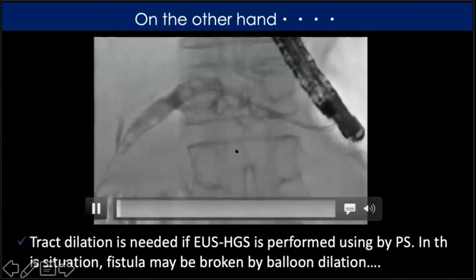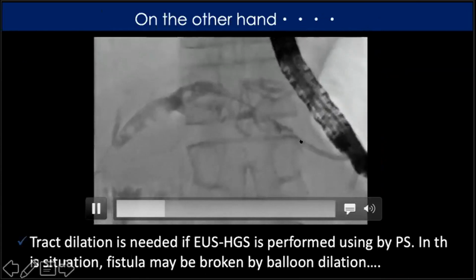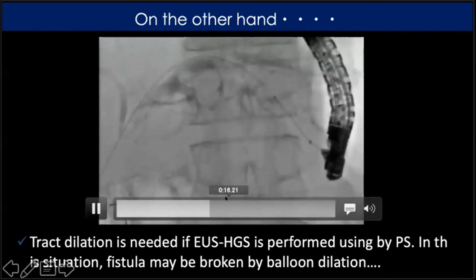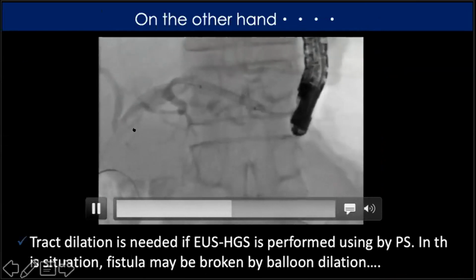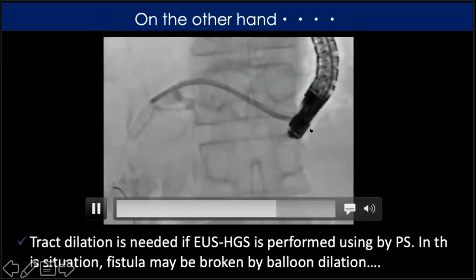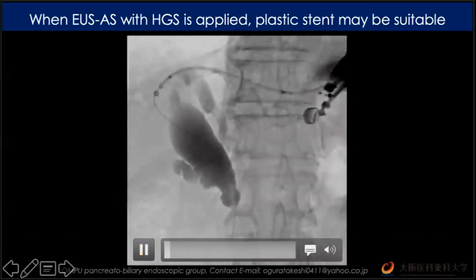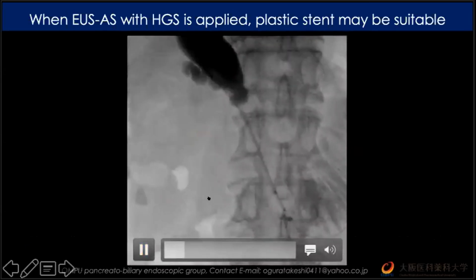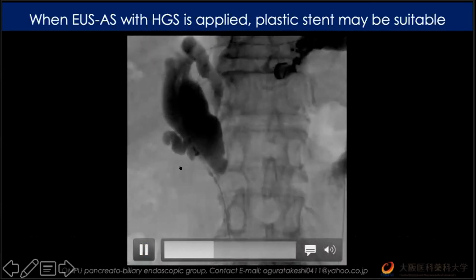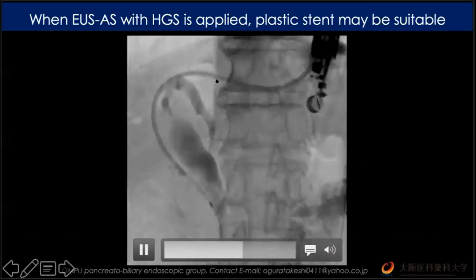However, as shown in this video, tract dilation is needed if EUS HGS is performed using a plastic stent. In this situation, fistula may be broken during tract dilation, like this. Therefore, if various treatment will be applied, metal stent has clinical benefit compared with plastic stent. However, when EUS-guided antegrade stent deployment with EUS HGS is applied, plastic stent may be suitable in viewpoint of cost effectiveness. So we usually, after antegrade stent deployment, to keep the fistula, we place a plastic stent.